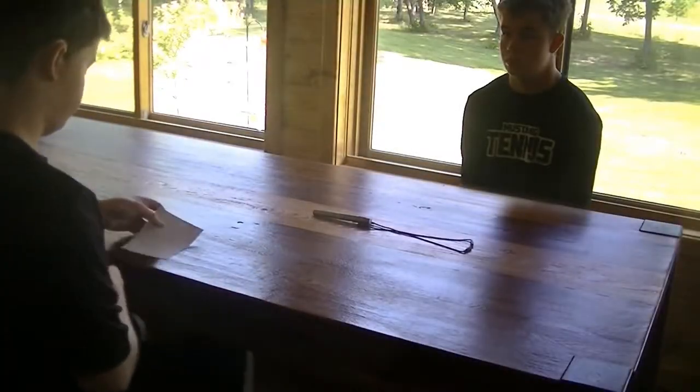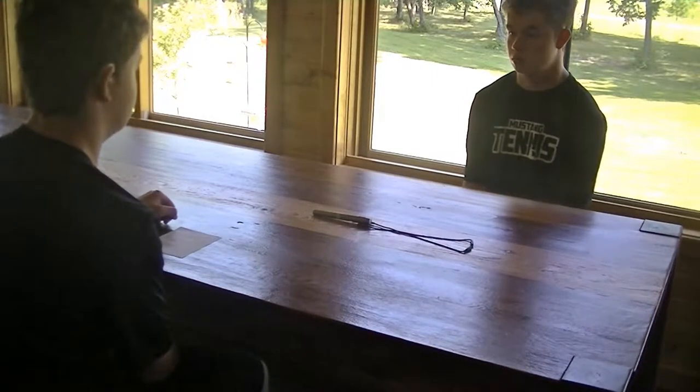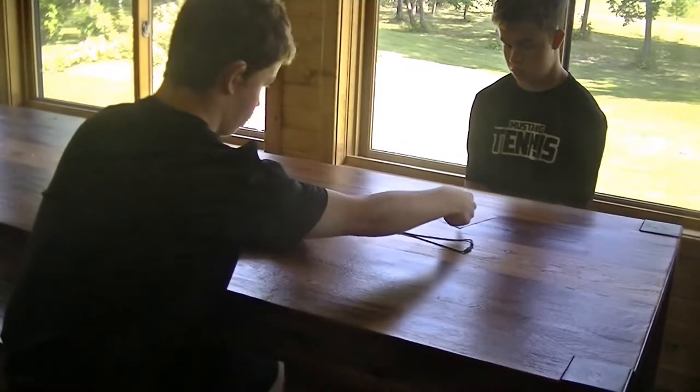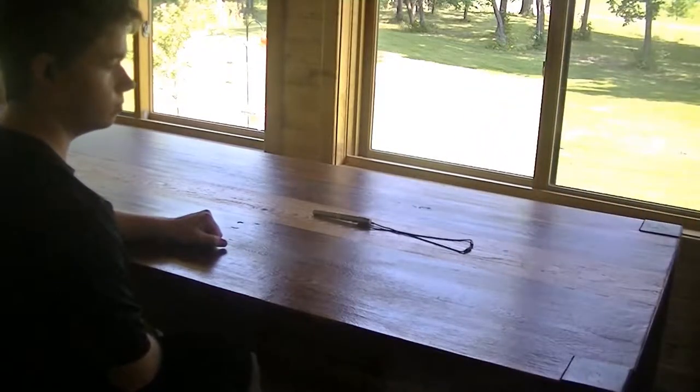The second mode is conference mode, which is omnidirectional and can pick up sounds from pretty much all around, like if it's in the middle of a big table. This would be a great alternative if you couldn't or don't want to pass around the mic for whatever reason. For some people, this could cause feedback if the mic is really close to the hearing aid, though that might not be the case for everyone.